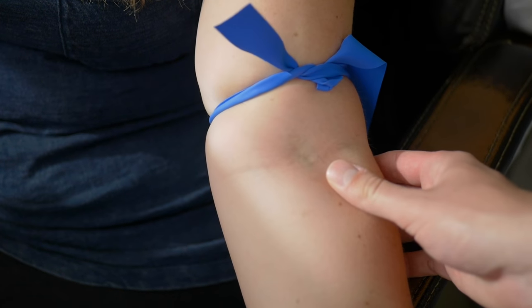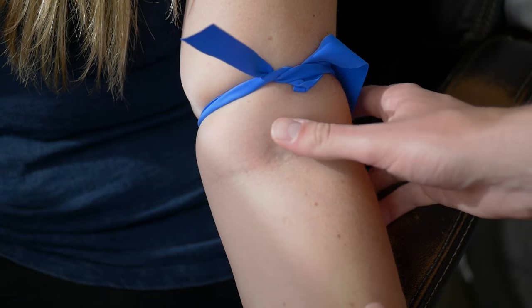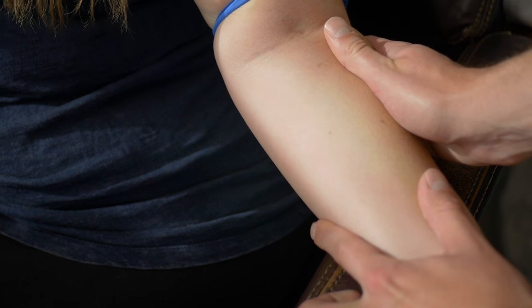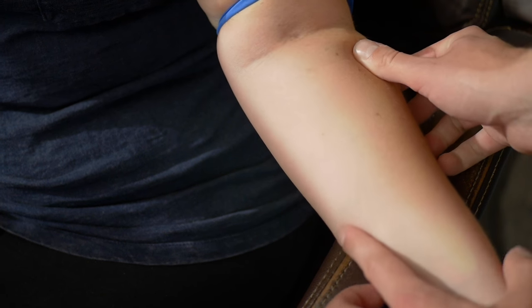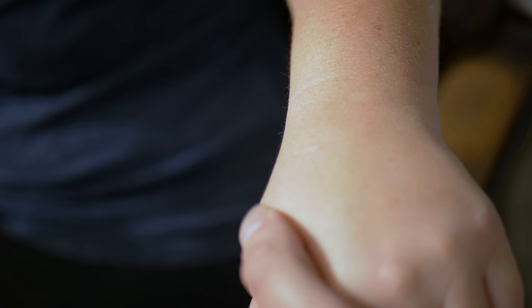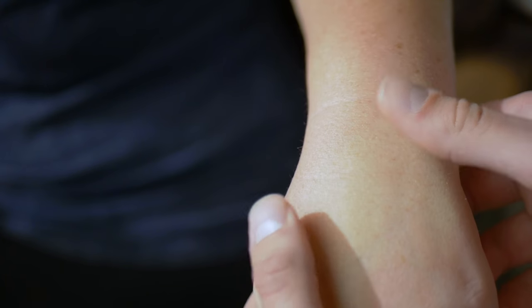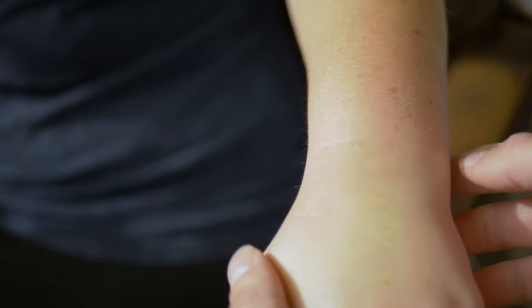There's a difference in finding veins on men versus women. Men tend to have less fat covering their veins and more muscle mass, so the veins stick out and are easier to find. For women, veins might be a little bit deeper. Here we're looking at another AC region and I'm using the sight method to find where that green-blue color of veins can be seen through the skin — this can save you some time. On the hand region you can see color differences that represent the veins underneath the skin.